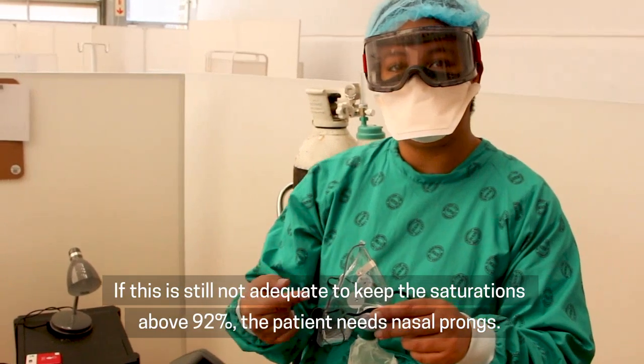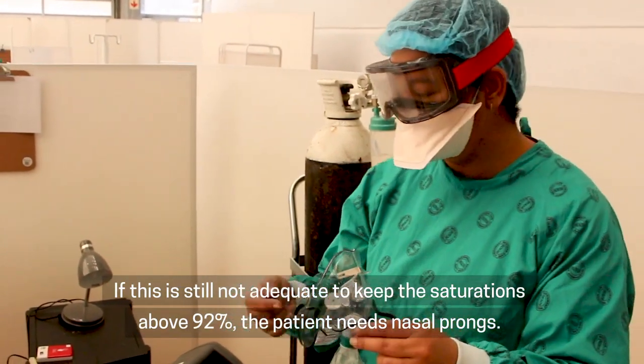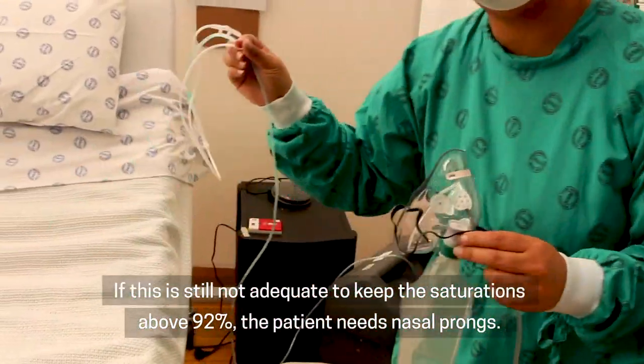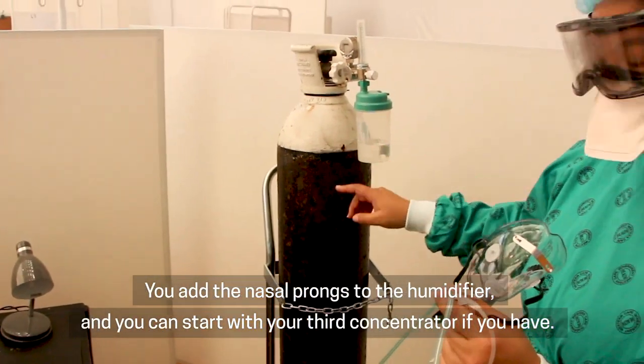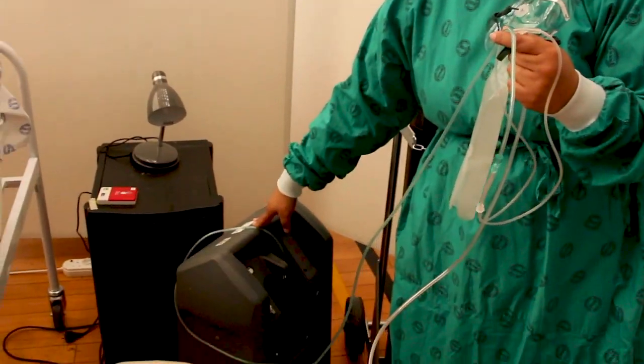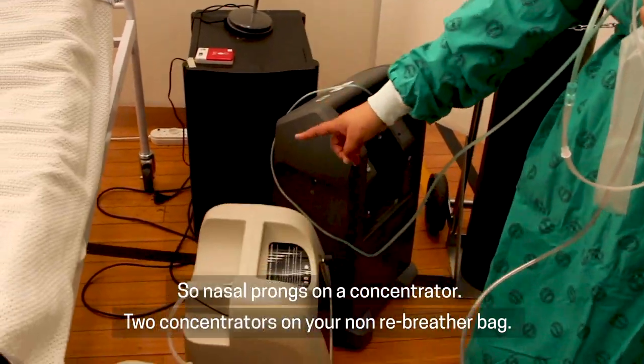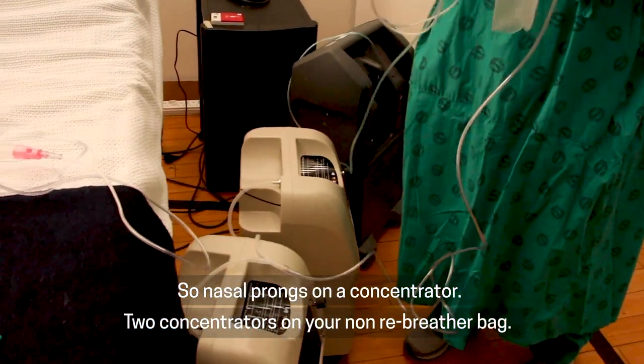If this is still not adequate to keep the saturations above 92%, the patient needs nasal prongs. You add the nasal prongs to your humidifier and you can start with your third concentrator if you have one. So: nasal prongs on a concentrator, and two concentrators on your non-rebreather bag.